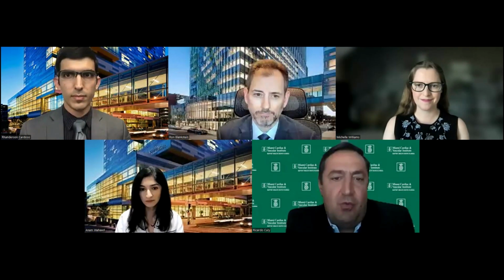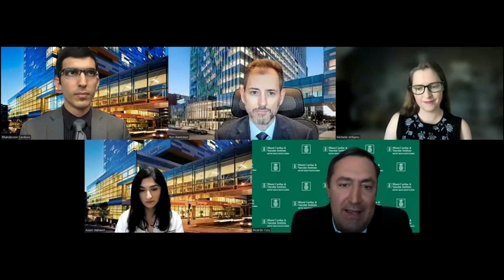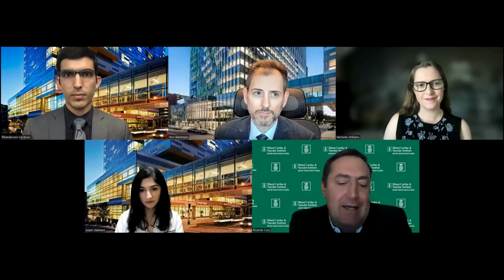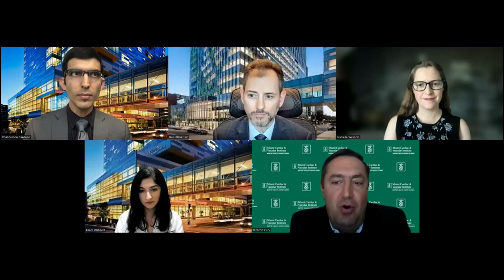Sure, Ron, great question. We discuss a lot the balance of having a classification that is relatively simple to put in place and to convey the information. That is why it's really important to emphasize that CAD-RADS is always complementary to the impression of the report.